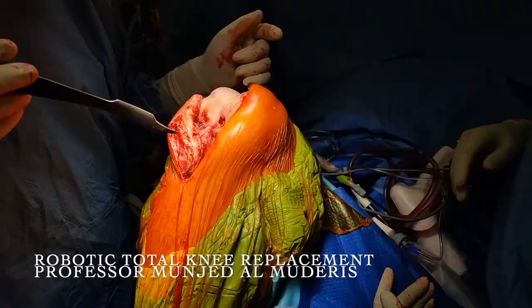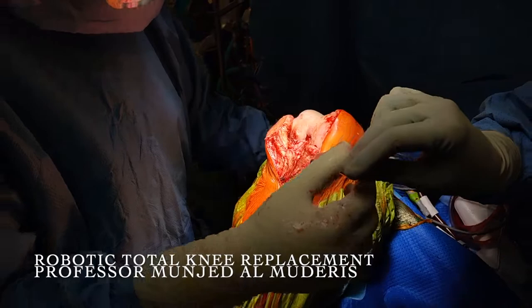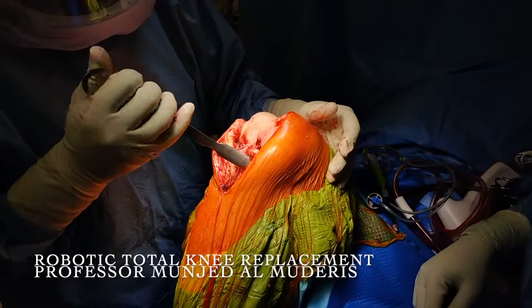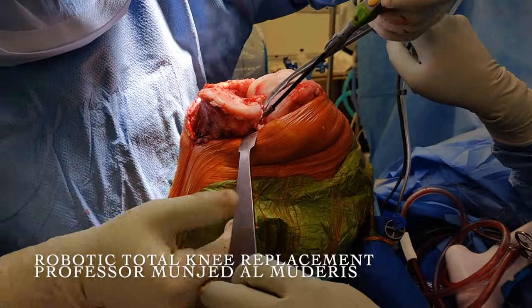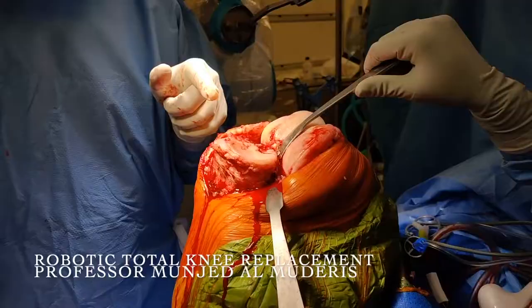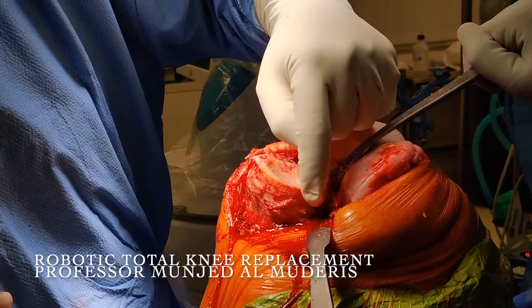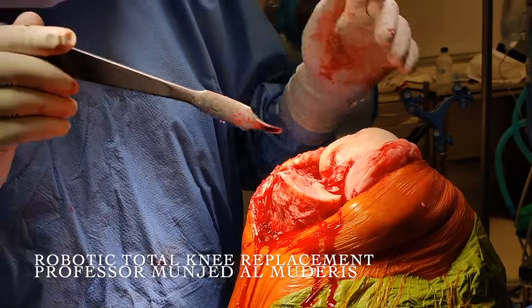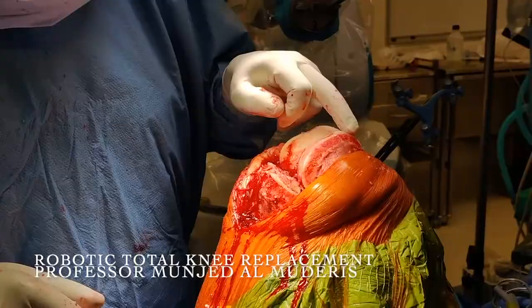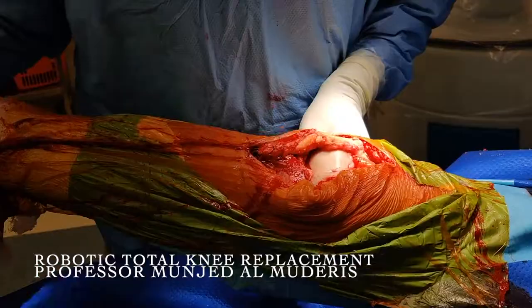This patient has severe varus malalignment, so it is mandatory that we perform extensive soft tissue releases in order to achieve balancing. I release the deep fibres of the medial collateral ligament but maintain the superficial fibres. We sublux the knee anteriorly. There are significant osteophytic changes on the medial side of the proximal tibia, and we carefully remove these osteophytes from the medial proximal tibia and the medial aspect of the femur. After removing the medial osteophytes of the femur, there is significantly more laxity medially, allowing the patient to have proper balancing.